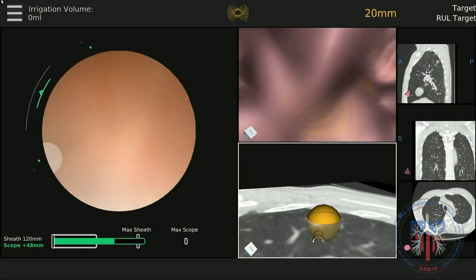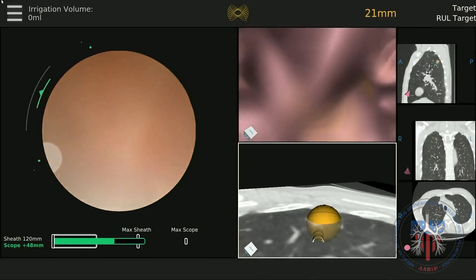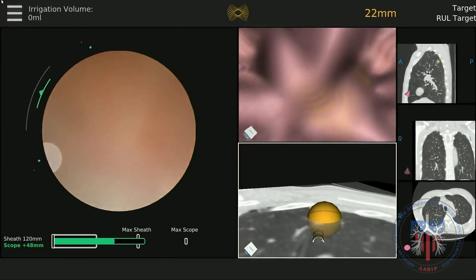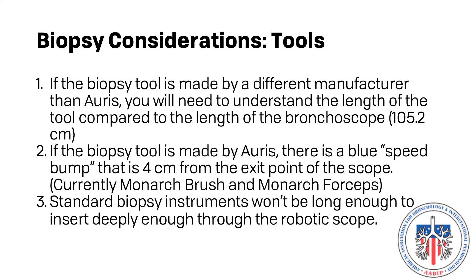Once the scope is in the correct position, biopsy of the lesion can commence. For any instrument that is used, it is important to understand the length of the biopsy instrument and how that relates to the length of the robotic bronchoscope. Only peripheral access instruments can be inserted all the way through the robotic bronchoscope. Since different peripheral access instruments have been created for different procedures and technologies, you must have a clear understanding of when the biopsy tool is about to extend out of the bronchoscope to safely and accurately biopsy.